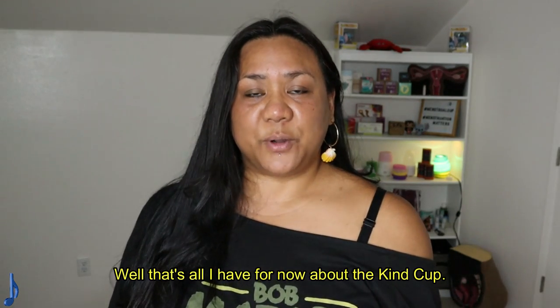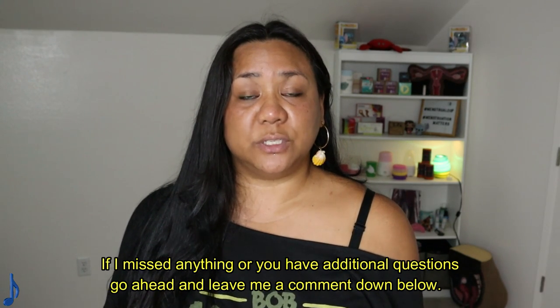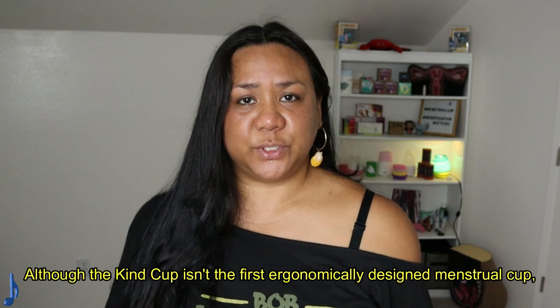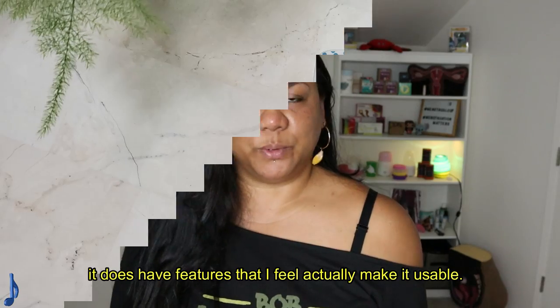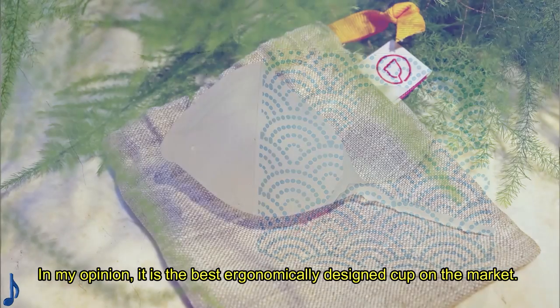Well, that's all I have for now about the Kind Cup. If I missed anything or if you have additional questions, go ahead and leave me a comment down below. Please check out the Kind Cup campaign on Kickstarter and help them out by making a pledge if you can. Although the Kind Cup isn't the first ergonomically designed menstrual cup, it does have features that I feel actually make it usable. In my opinion, it is the best ergonomically designed cup on the market.